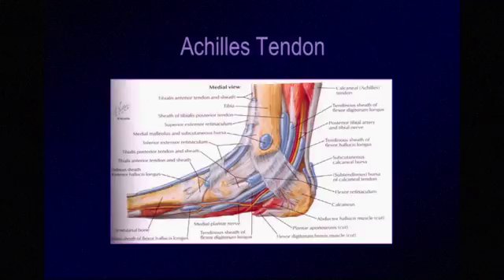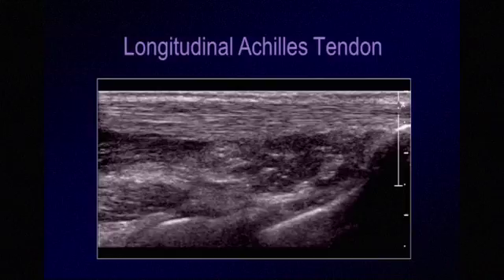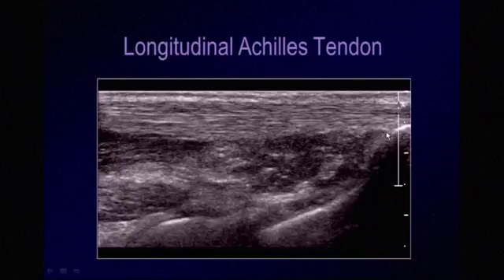The ankle is divided into four compartments and can be imaged in four compartments. For the posterior compartment, we will be discussing the Achilles tendon, which is outlined in blue in this Netter diagram. The appearance of a normal Achilles tendon is the same as with any tendon in the body. Tendons are hyperechoic, composed of fine parallel echogenic lines which represent collagen fibers. Here we are looking at the Achilles tendon from proximal to distal towards its insertion onto the calcaneus.